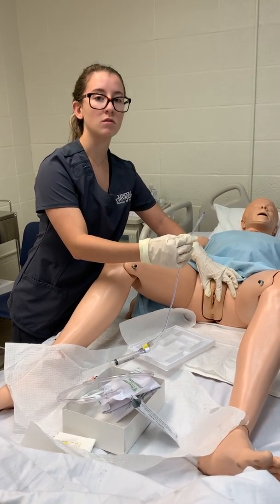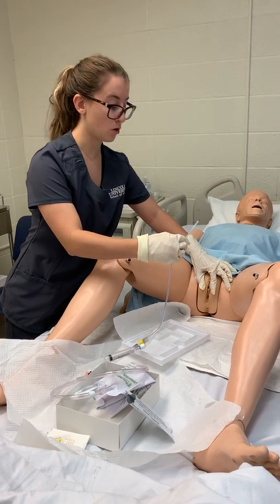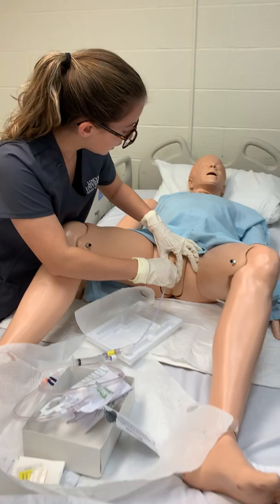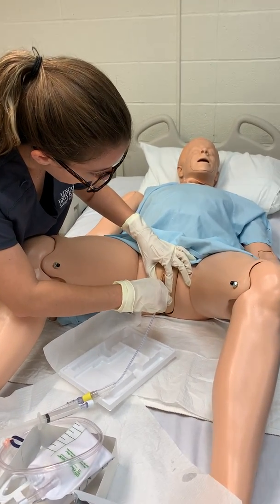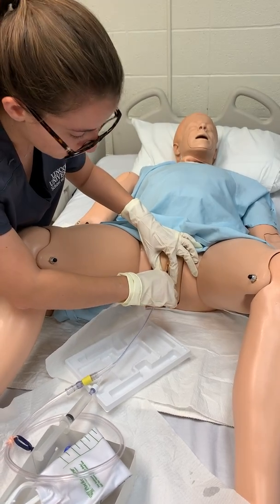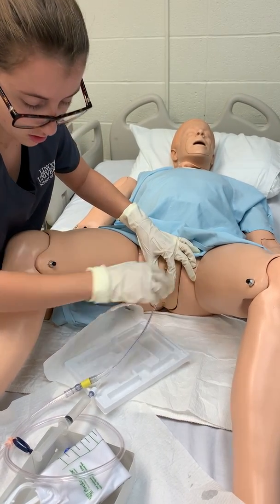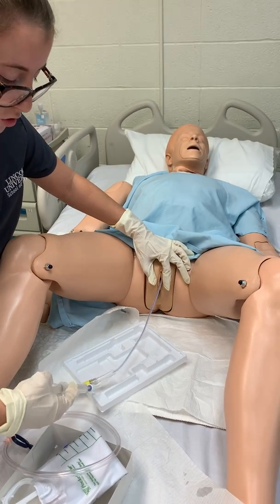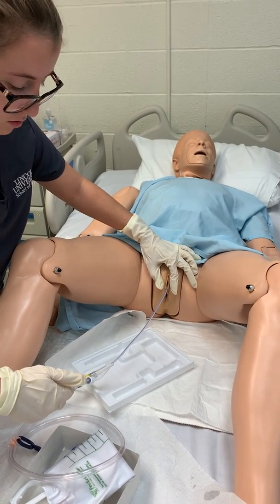So now I'm going to go ahead and take my tube, insert it 2 to 3 inches, and once I meet urine return, then I'll go ahead and insert it 2 more inches. So Miss James, just go ahead and take a deep breath in and relax. And I'm going to go ahead and insert this tube. Alright, so now I've seen urine. So now I'm going to go ahead and insert 2 more inches and inflate my balloon.